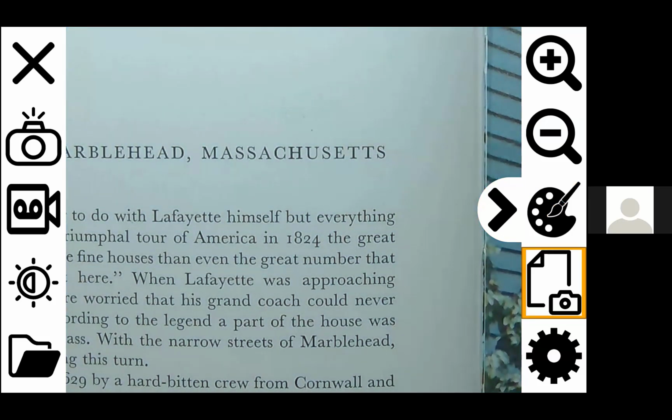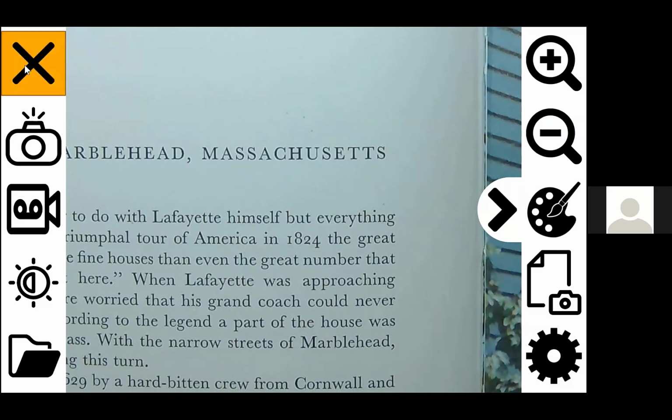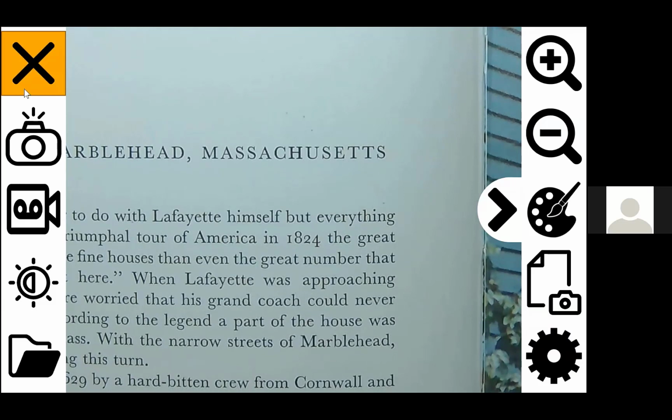Moving further down on the right-hand side, the next option down is your OCR camera. And then of course your settings is the bottom right. Moving over to the top left, your X is going to X you out of the program altogether. Then you've got your capture button, or your camera. It's a camera image, and it's going to do a snapshot of what's on the screen or in the distance view. Below that is your record button.